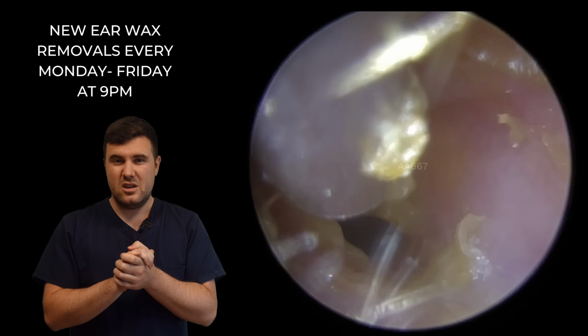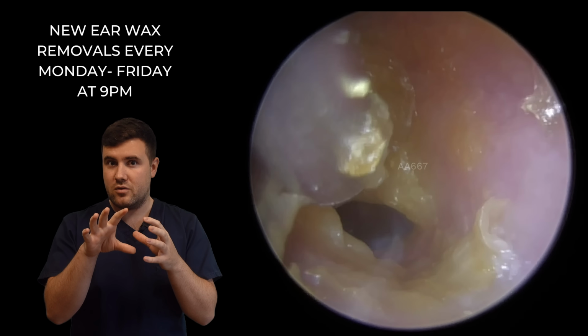Now what we've got left is this very soft, wet material that's left inside, deep in this ear canal. Now you can see it's not fully blocking the rest of the ear canal, but we just need to touch up on this last little bit. Now you can see this all just suctioning down straight away. So we've still got the standard size on the tube at this point. So we're going to switch over to a fine end in a second. Just going to try and clear as much of this debris as we possibly can here. Again, we've already done the job. We've cleared the plug, but we just need to clean some of these smaller little pieces away.